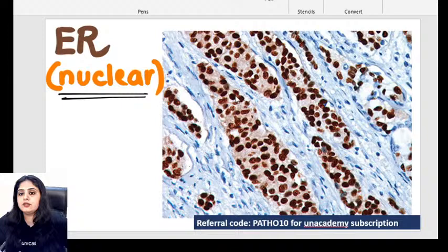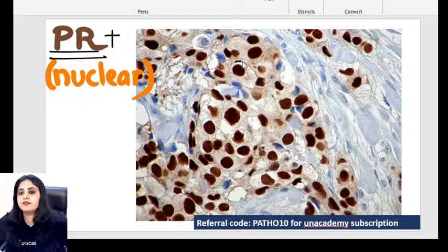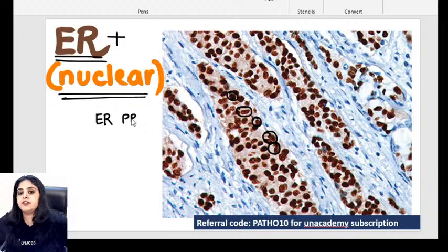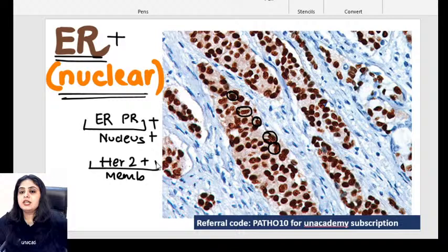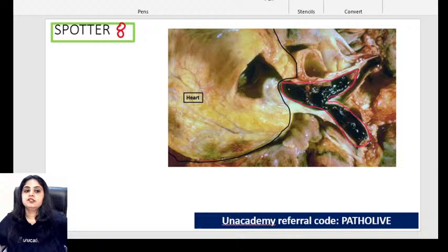For breast IHC we do ER, PR, and HER2. ER positivity gives brown color in the nucleus; PR positivity also gives brown color in the nucleus — because estrogen receptor and progesterone receptor are nuclear receptors. HER2 positivity gives brown color in the membrane of the cell. You cannot differentiate ER from PR just by looking — the exam will tell you which is which. But HER2 is distinct because it is membranous.